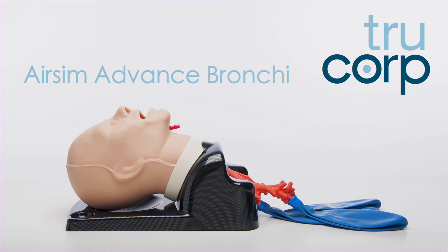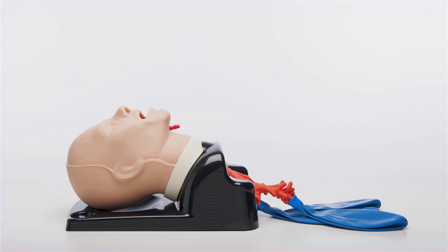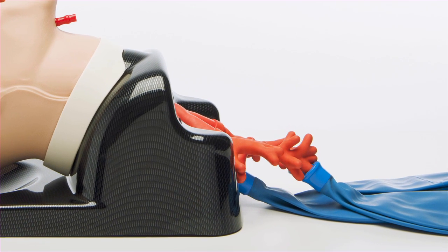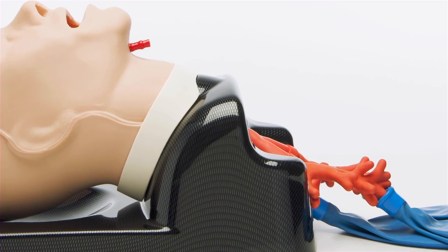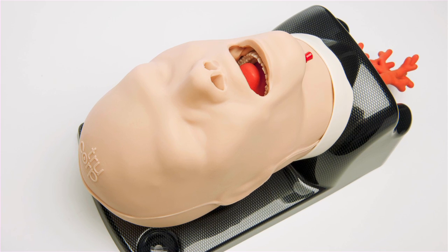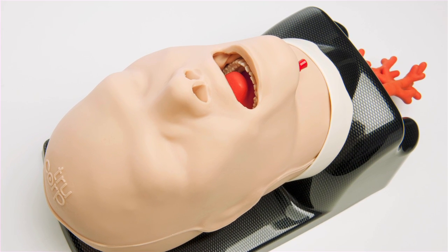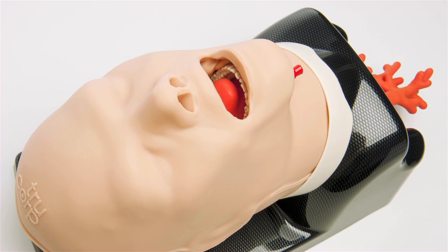The AirSim Advanced Bronchi is used to educate and improve competency amongst clinical specialists in a range of airway management skills. The model provides internal anatomical detail down to the fourth-generation bronchi, facilitating fibre optic bronchoscopy techniques. The tongue within the model can be inflated to illustrate tongue edema for increasing difficulty during intubation. The real-feel high quality silicone material used is both durable and lifelike.